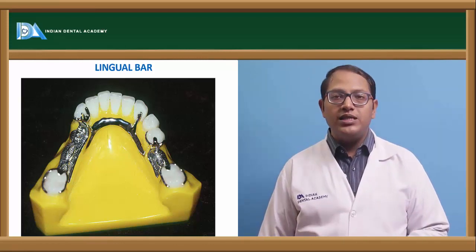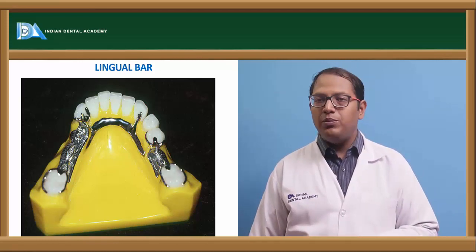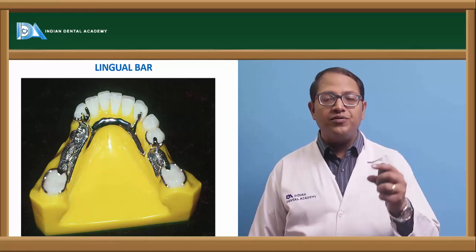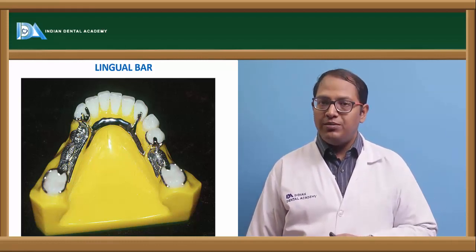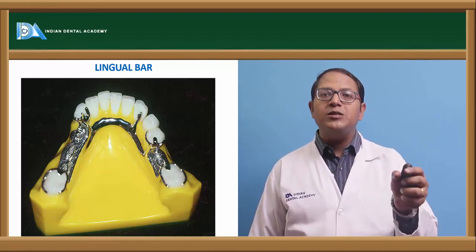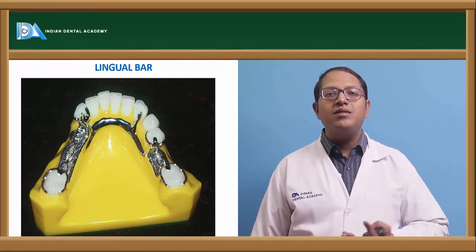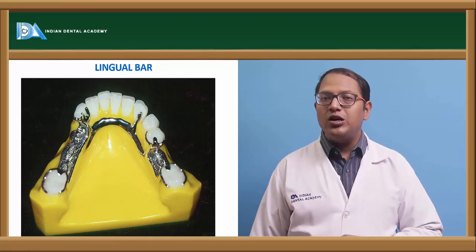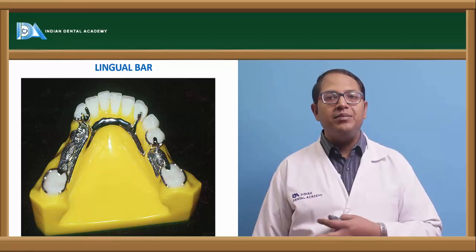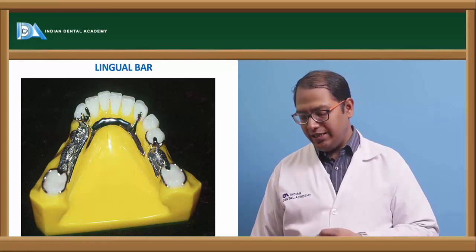Now the problem occurs when your technician, or the person who is going to fabricate this particular lingual bar, is not efficiently trained. If you do not have enough sulcus depth, and the person has prepared the lingual bar thin, what happens? It starts flexing. The rigidity comes into question and it simply breaks off. So that's the biggest disadvantage with the lingual bar. Otherwise it can be used everywhere, with the added advantage that it doesn't cause decalcification of the teeth.